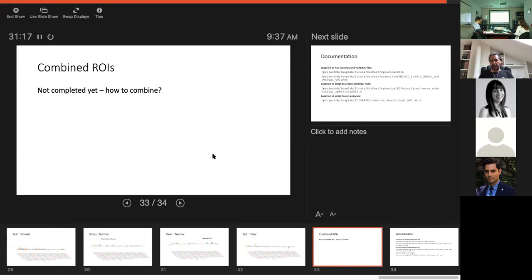But before we even get to that, there are other things we should first consider, which is whether we want to look at MNI coordinate ROIs or probabilistic atlases, whether we want to smooth or not, whether we want to use subject-specific ROIs. I don't want to generate thousands of potential candidate results with different variations of everything. So I think we should figure out which one we want to try first, and then follow that approach.